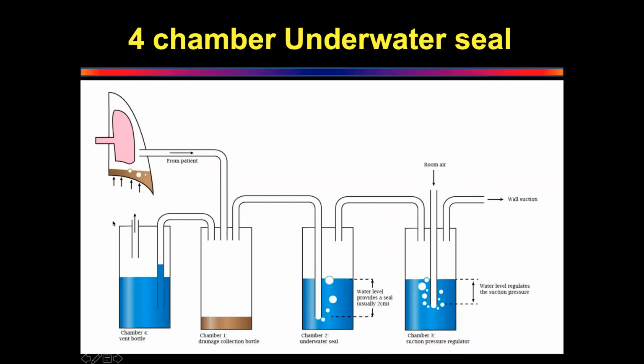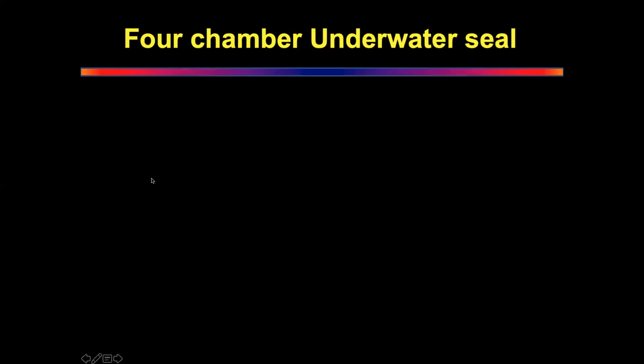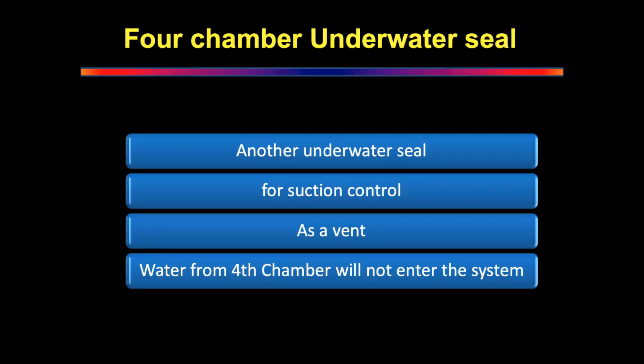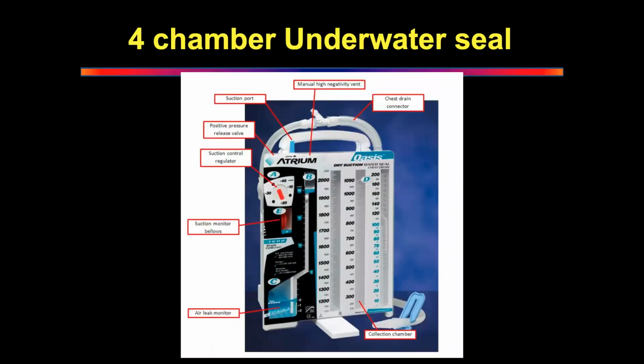So the fourth chamber is a vent which is added to the bottle to make sure that if any of this blocks, you still have air to escape out.